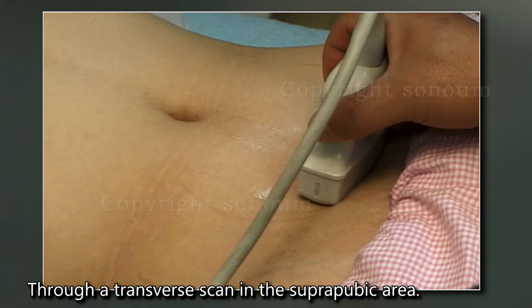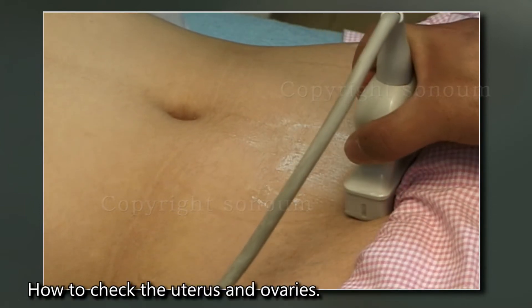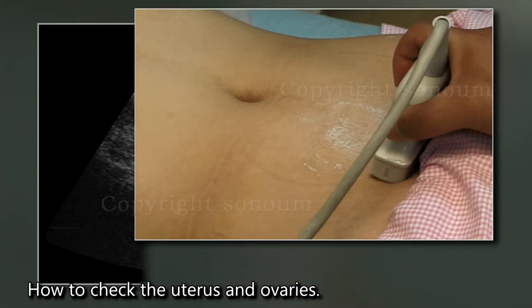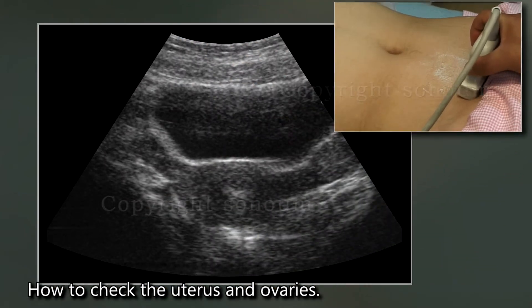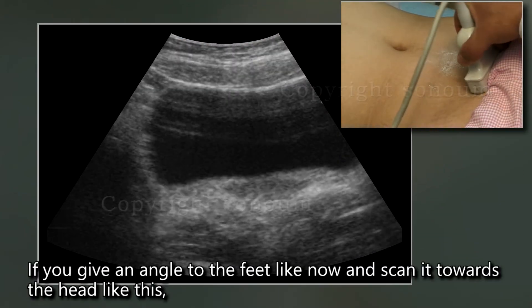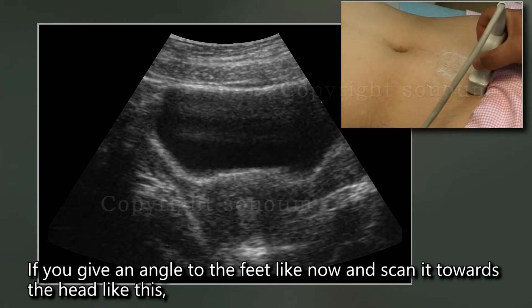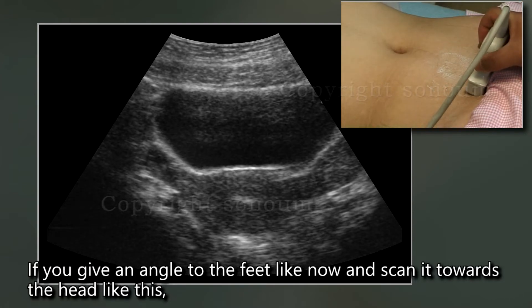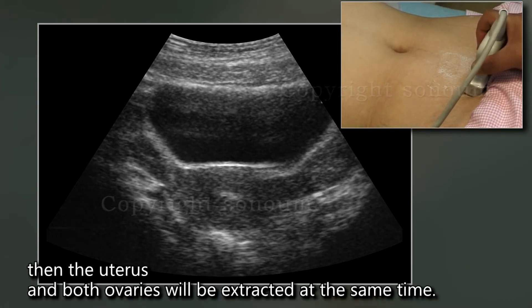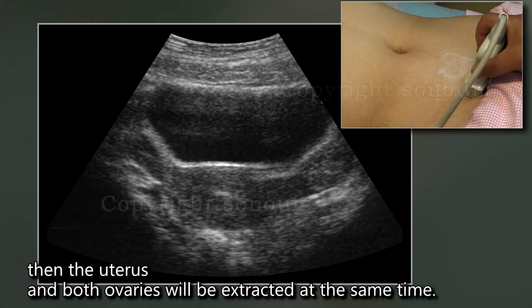Through a transverse scan in the suprapubic area, here is how to check the uterus and ovaries. If you angle the probe toward the feet and then tilt it toward the head, the uterus and both ovaries will be visualized at the same time.